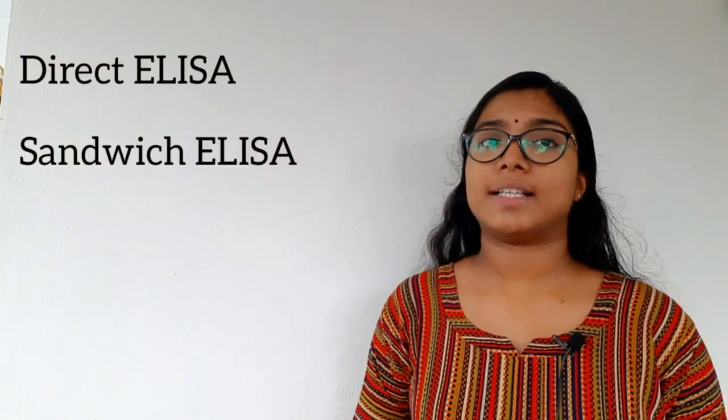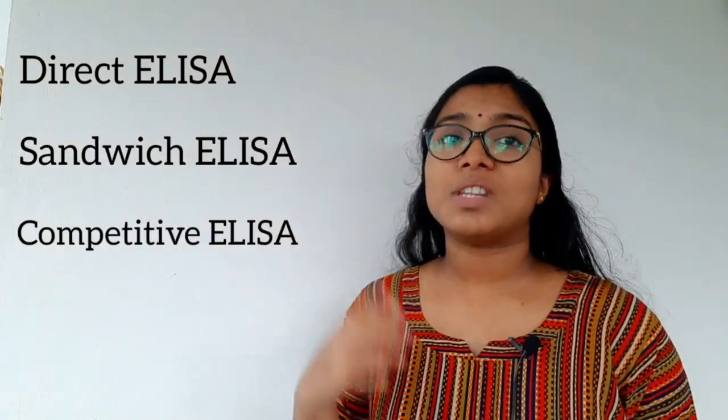Now moving on to the types of ELISA. The common types of ELISA are direct ELISA, sandwich ELISA, competitive ELISA, and reverse ELISA. These categories are based on how many types of antigen and antibody are used and how they act.